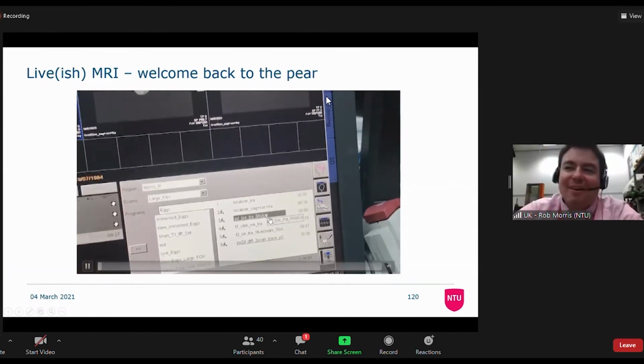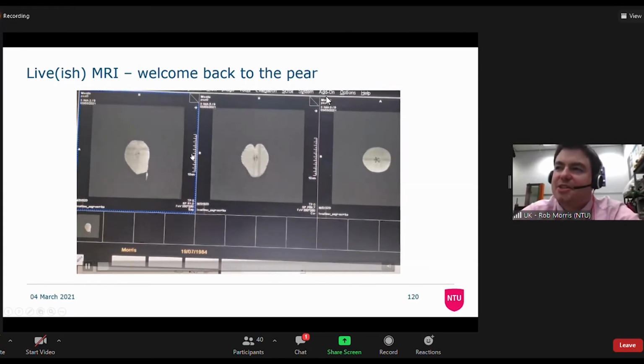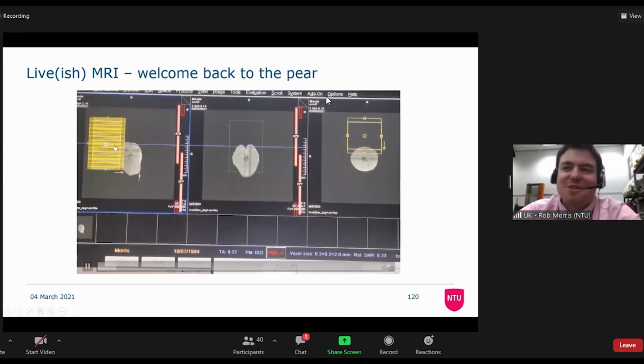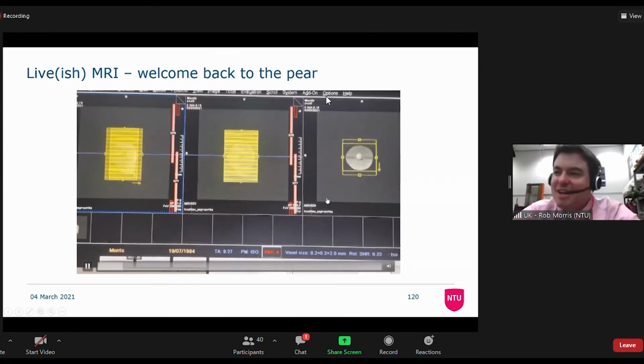So we've now got our localizer, and we're going to copy over this sequence here, which says it's 64 slices because it's meant for scanning other things. We don't want to do 64 slices. We had 19 before, so we need to set it up and drag it around a bit, and it takes a little while.